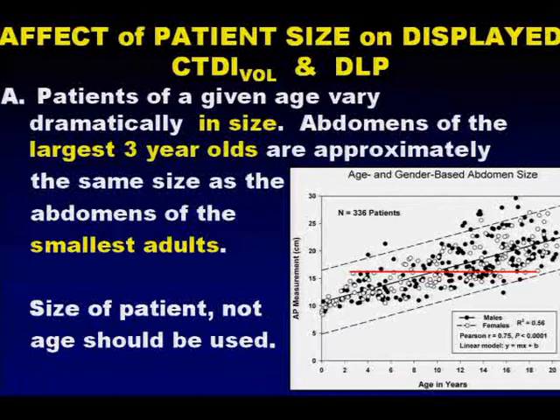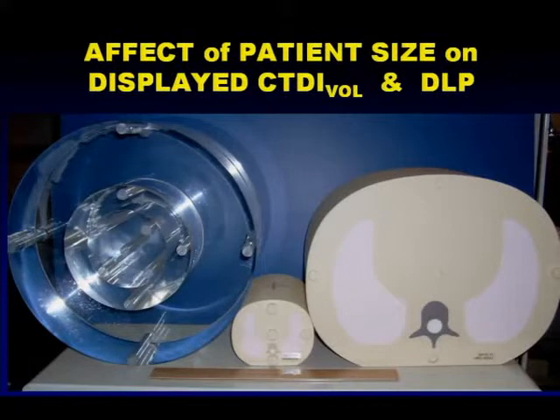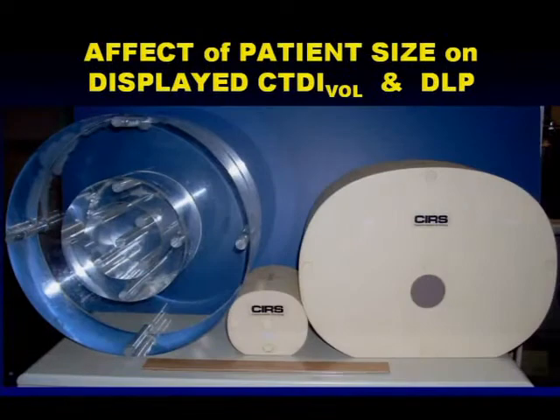Some people use weight. Weight's a better moniker than age. However, obviously I can have a tall, thin patient or a relatively short, stout patient, and weight is not going to delineate between those two. Today we have anthropomorphic CT phantoms that certainly are much better models of what's going on in the pediatric world than the CTDIvol phantom. The phantom there in the center represents a 1-year-old thorax. You see the lung field there and the spine, and the phantom on the right is the adult, and of course the PMMA phantom on the left is the CTDI phantom.